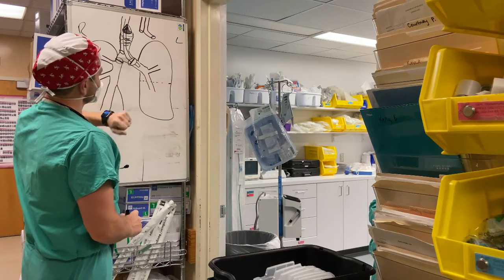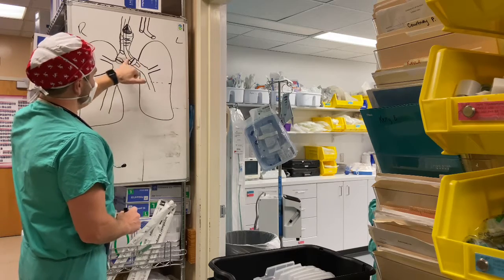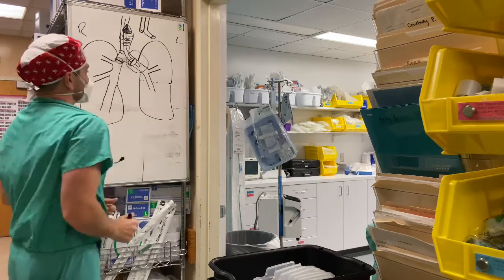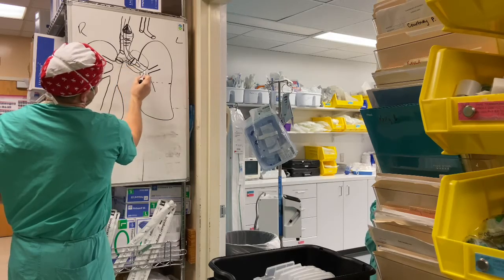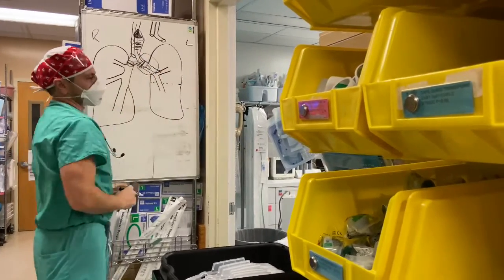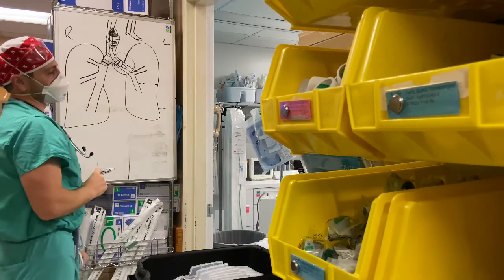So with a left-sided tube, it's really easy to place this balloon because just about everybody has consistent anatomy right here. Okay? It's almost always the same. And there's a fair amount of distance between where this bifurcation happens and where the takeoff of the left upper lobe is. So it's really rare that you would be too deep and missing that lobe when we're trying to ventilate it. The right side, there's a ton of variability.